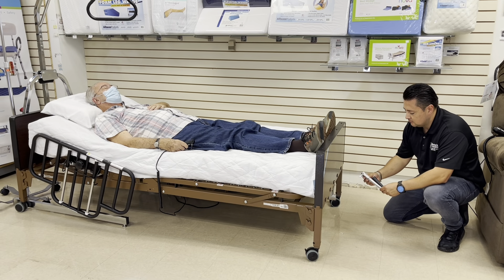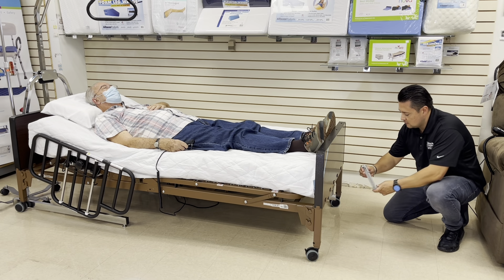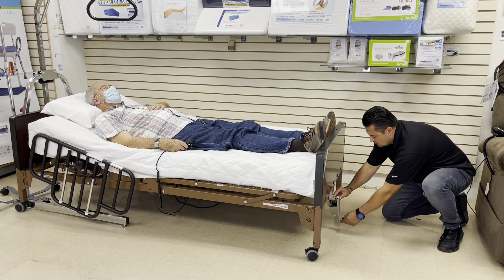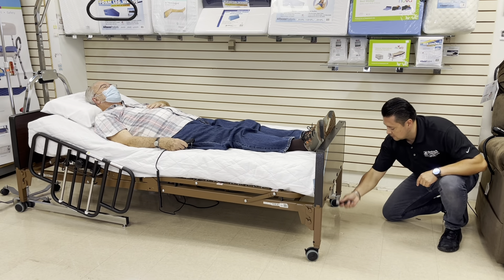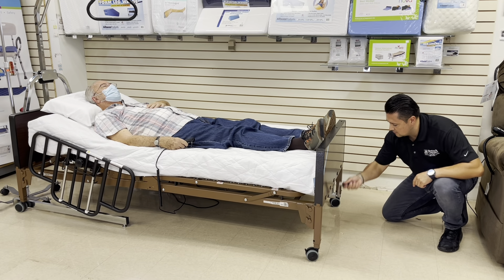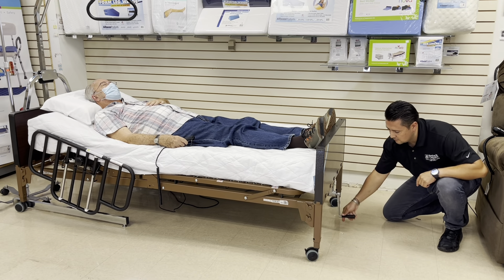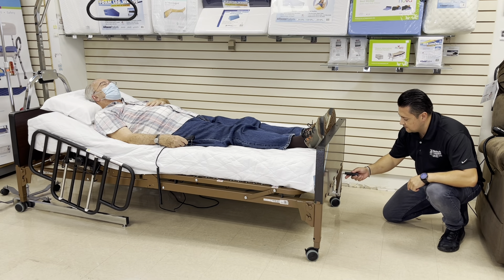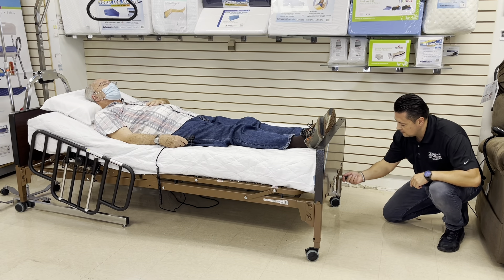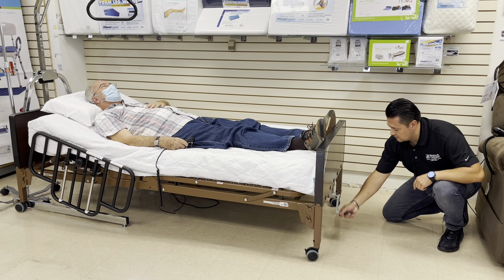At the foot of the bed, you will see the crank housing unit in which you insert the crank to raise the entire bed. Turning the crank clockwise to the right raises the height of the bed, as you can see on all four corners. Turning the crank counterclockwise to the left will lower the height of the bed to the caregiver or loved one's ease.